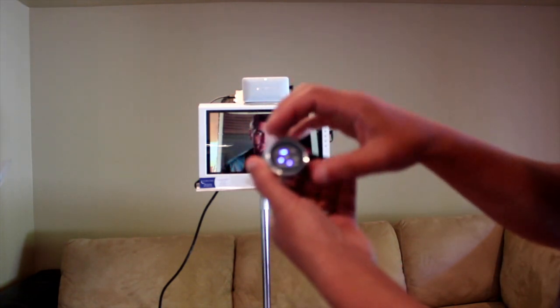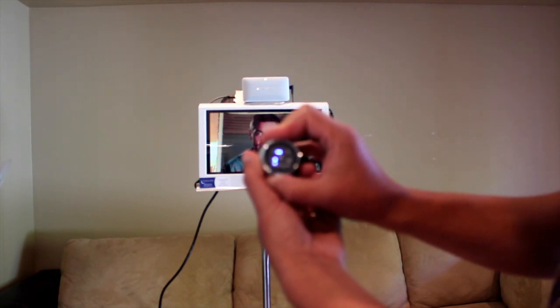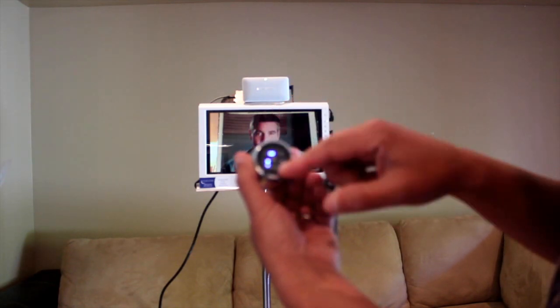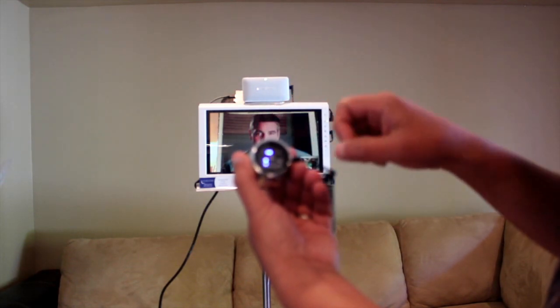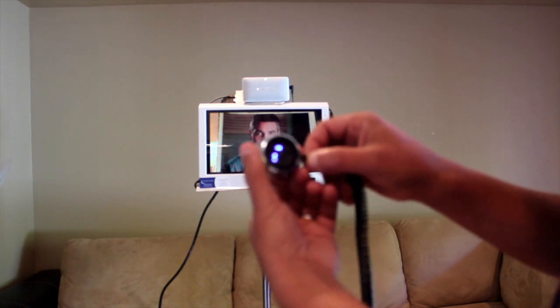The stethoscope is very powerful. I suggest you start using it at a volume between 3, 4, or 5. If you use it at a higher volume — including 8, 9, or 10 — it may distort the sound through the internet.